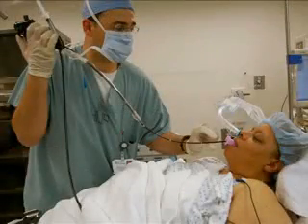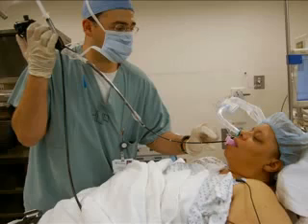The American Society of Anesthesiologists' difficult airway guidelines recommend an awake fiber optic intubation as the gold standard technique in managing a patient whose intubation has been challenging by traditional techniques.